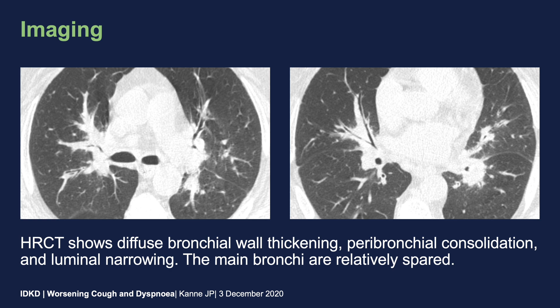These two axial images show similar findings, with diffuse bilateral bronchial wall thickening, peribronchial consolidation, and luminal narrowing. Note that the peribronchial consolidation has rather irregular margins. The main bronchi, as on the previous image, are relatively spared.